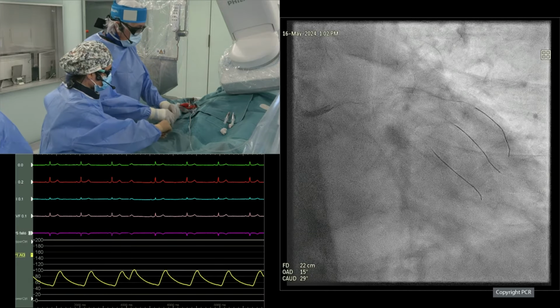Okay, there is some interesting image also in the distal marginal that was not present before. That we also need to check. Distal to this branch. Oh no, it was there already actually. Yeah. It's now probably a little bit of spasm also there. No, we're fine. So we're going to co-register. You can see that this is really fast with OCT. Even in a tortuous vessel, the system is quite good. You can always edit it anyway. Yeah, oh, the wire came out. I'm afraid that the wire came out, yeah, okay.